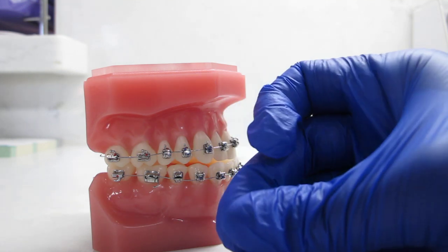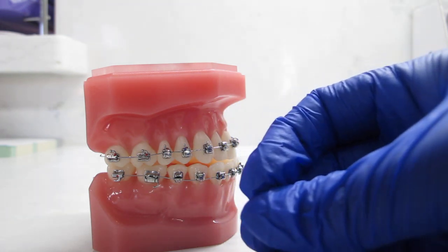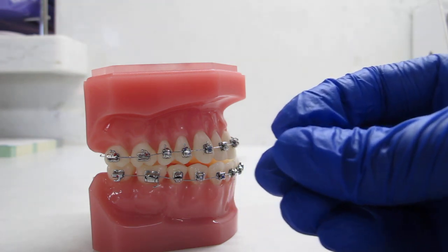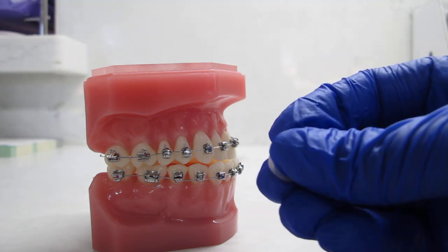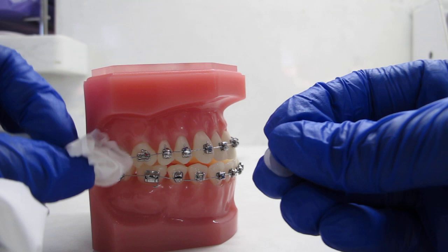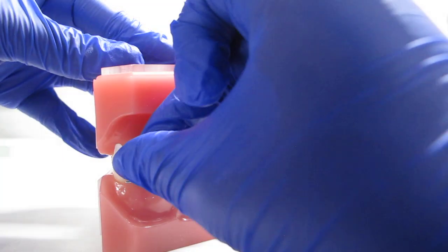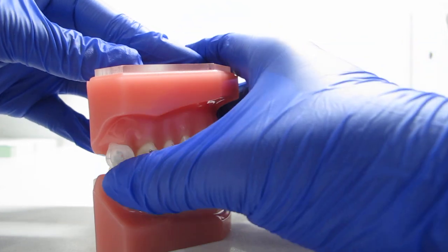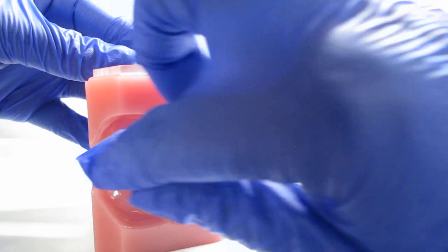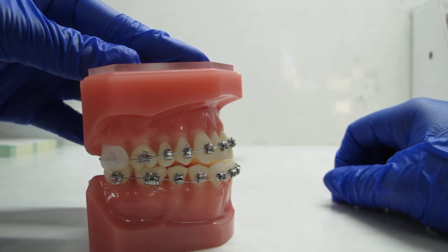The trick to this is making sure that you dry the area off first, or else the wax will not stick. So dry off the area, place it on whatever is bothering you, whether it's a wire or a bracket, and it acts as a cushion.